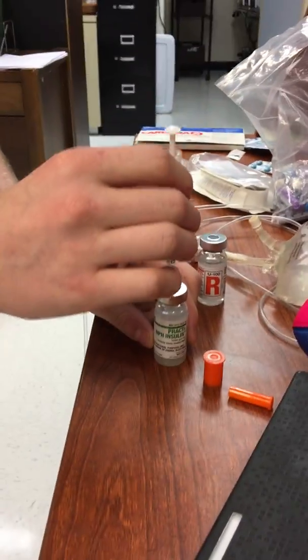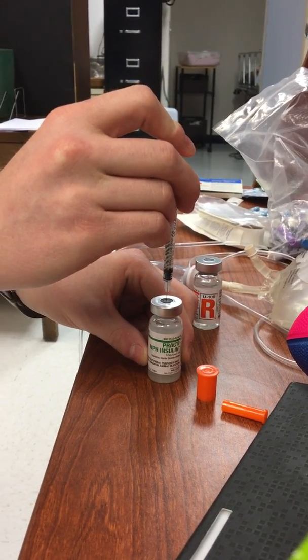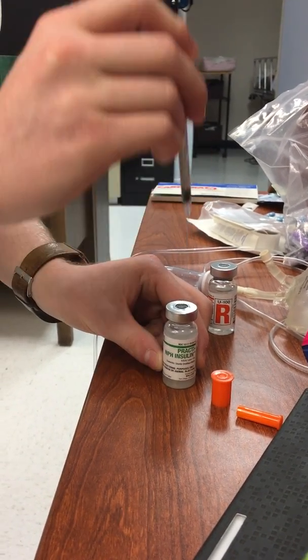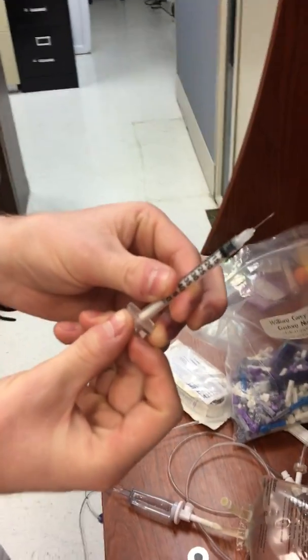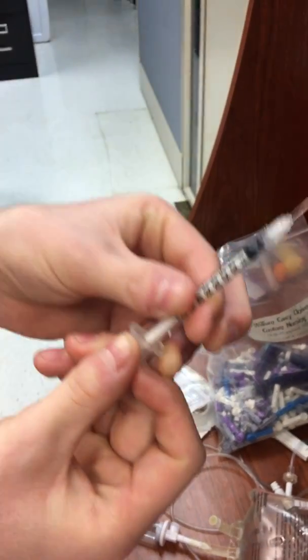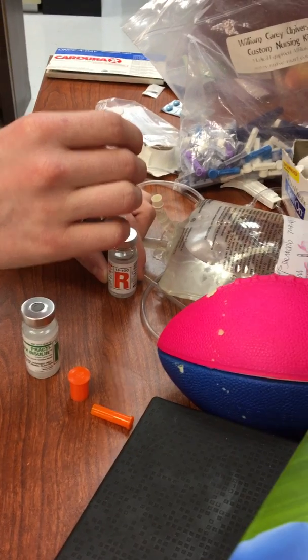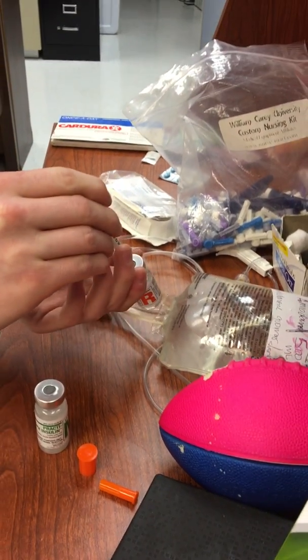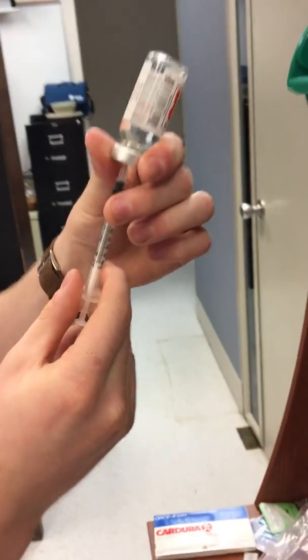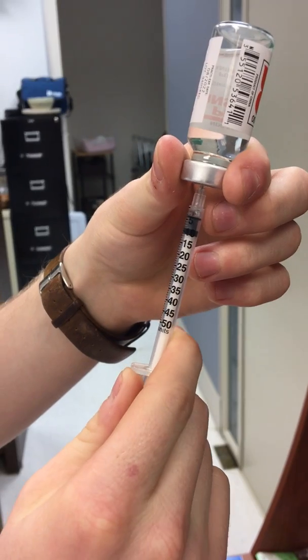being careful not to touch the needle to any of the solution. Carefully bring it out. And then we need 5 units of regular insulin as well. So I'm going to draw back 5 units of air and put it into the regular insulin. I'm going to inject that. Now, we're going to pull back 5 units of the regular insulin.